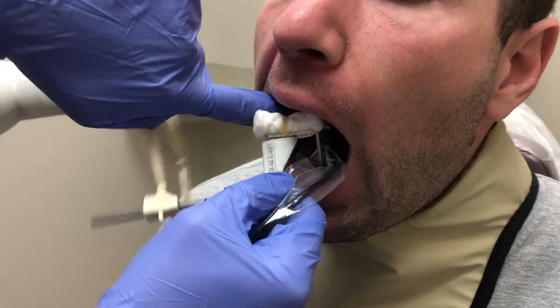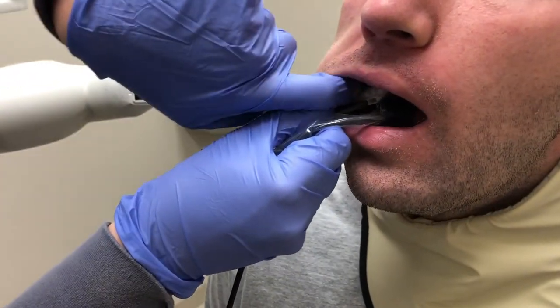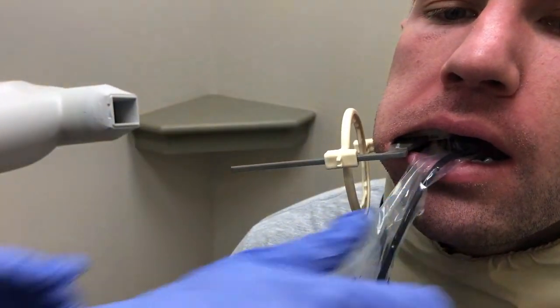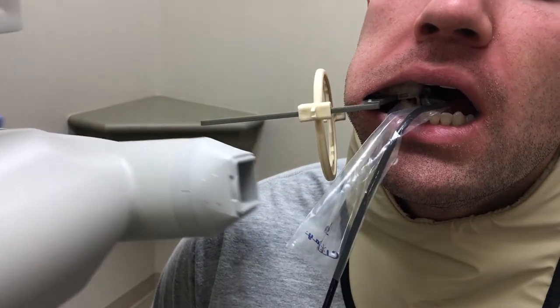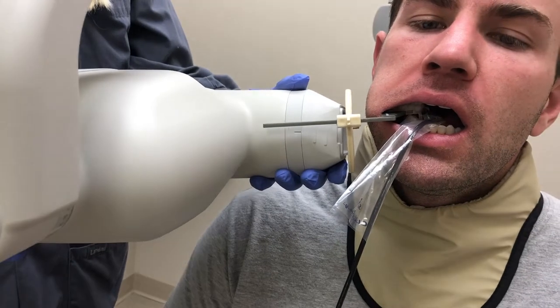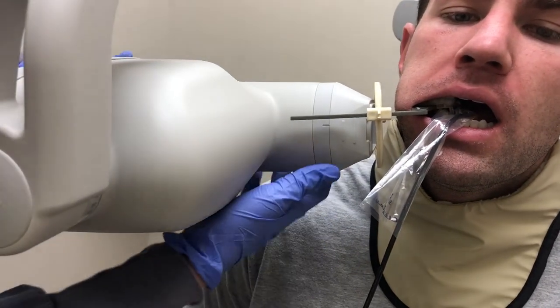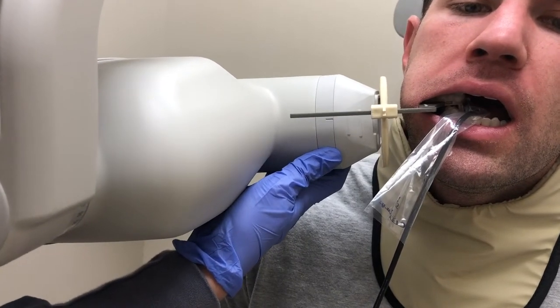To capture a mandibular premolar periapical radiograph, gently place the sensor between the tongue and the premolars of the patient's mouth. The sensor should be parallel to the long axis of the tooth and the buccal plane of the premolars. The position indicating device of the x-ray tube head needs to be aimed toward the center of the offset aiming ring and should be parallel to the rod.